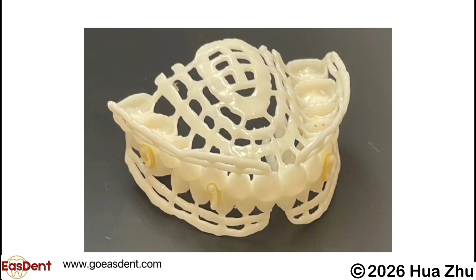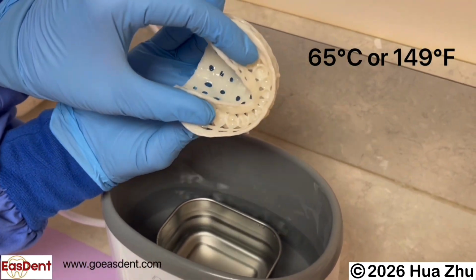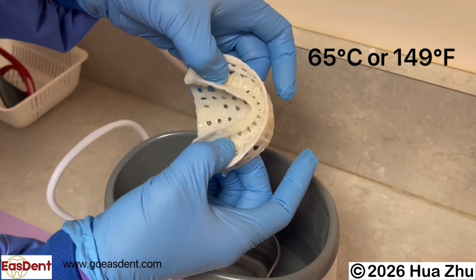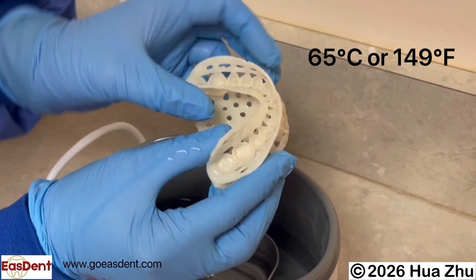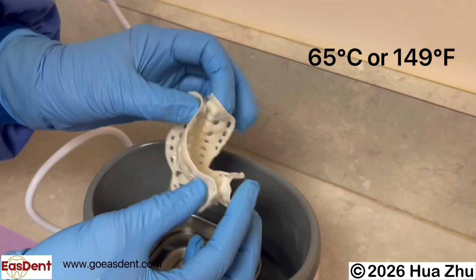Pick a set of Easdent trays that best match the arches. You can adjust Easdent trays to better fit the patient's arches. If the Easdent trays are too wide or too narrow for the arches, you can put both Easdent trays with elastomers in hot water, 65 degrees Celsius or 149 degrees Fahrenheit, and make the Easdent trays wider or narrower.